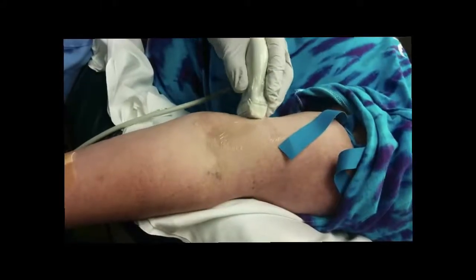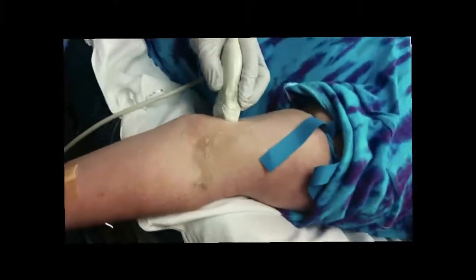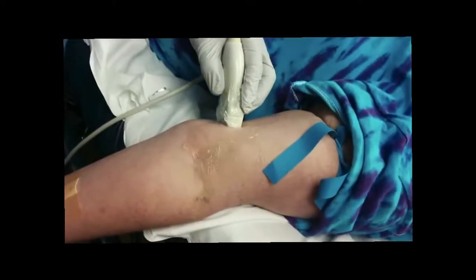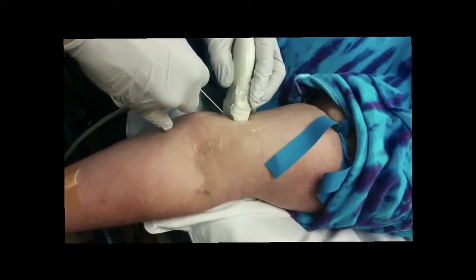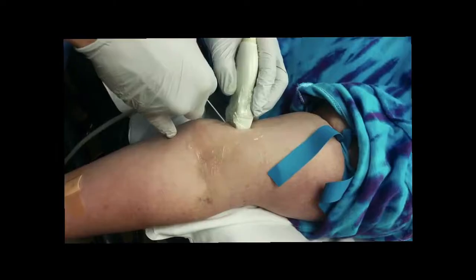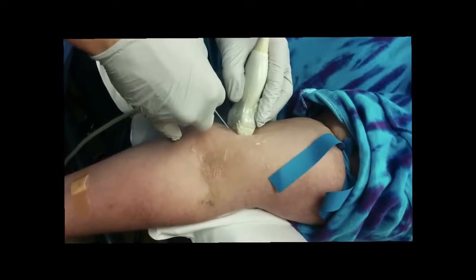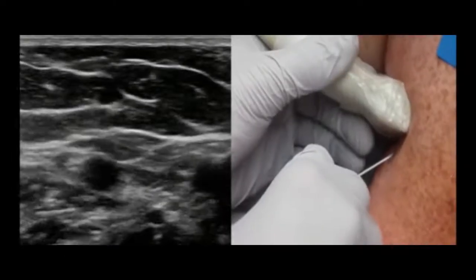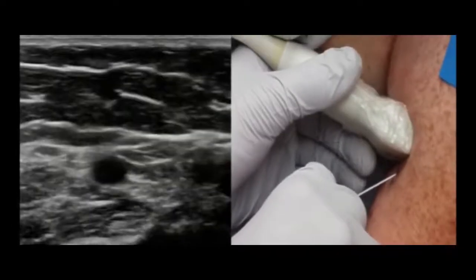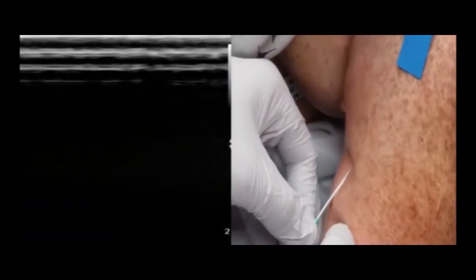Here's a video of me actually performing the procedure. I identify the vein and move the probe up and down the patient's arm to make sure I'm in the right axis — that vein stays in the middle of my screen. I know that if I put my needle in at a 90-degree angle to the transducer, I will be in axis. Once I get underneath the skin, I make sure to move my transducer back and forth, always keeping track of the needle tip until I get into the vein. Then I put the transducer down and flatten the catheter before advancing it to make sure I stay in the vessel.